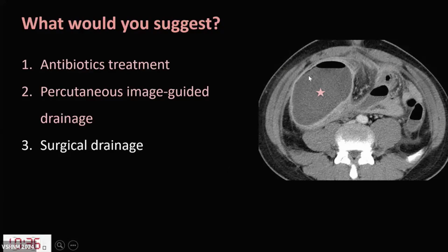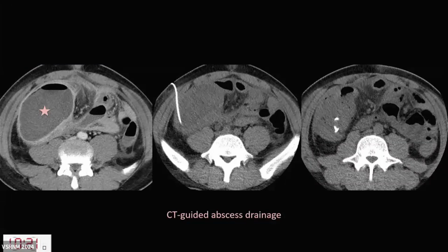Okay, so for the abscess, of course we use antibiotics, but these large abscesses need to be drained, and this is accessible, and so percutaneous image-guided drainage is suggested, and CT-guided drainage was performed. We inserted a pigtail catheter for the drainage of the abscess.